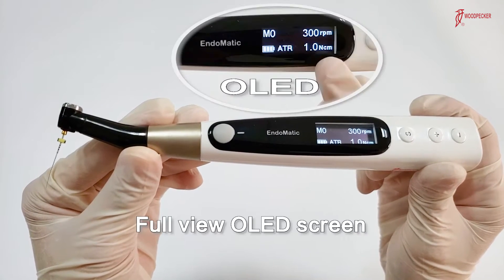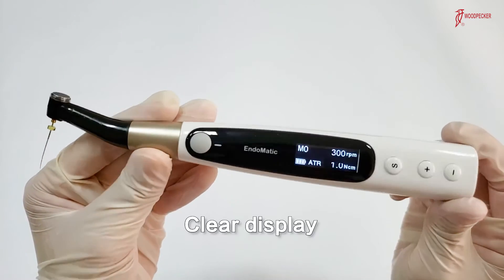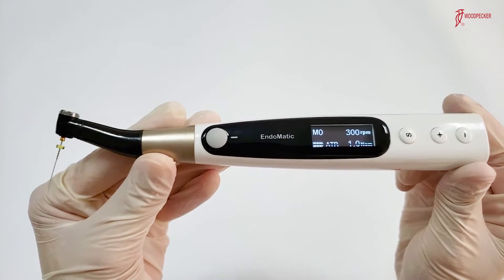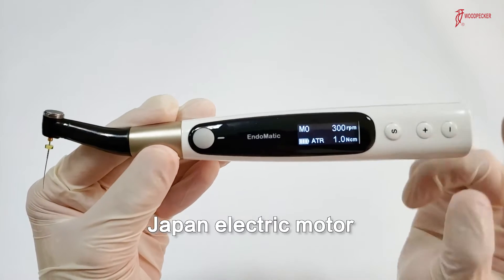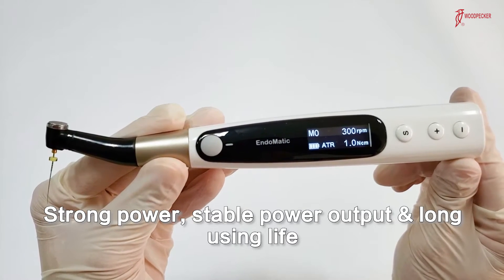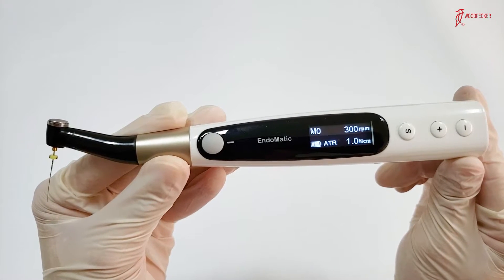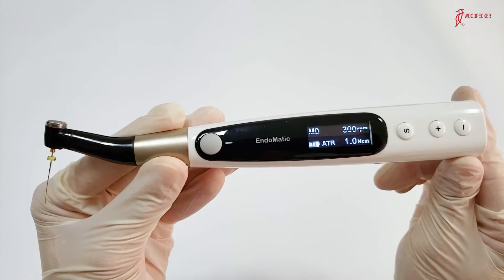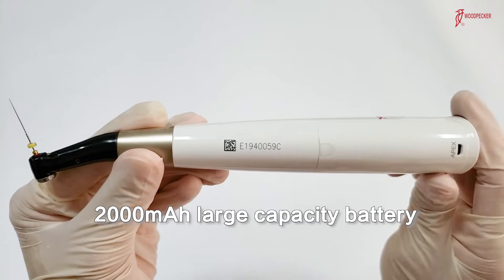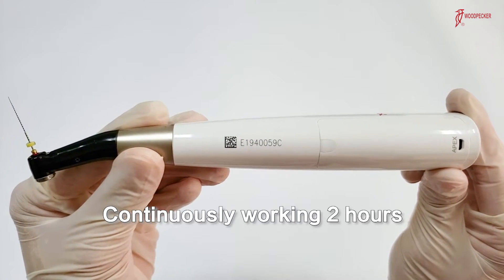EndoMatic adopts a full view OLED screen, so it's easy to see the information on the display from all angles. EndoMatic has a high-quality Japanese electric motor, ensuring strong power, stable output, and long service life. To ensure operating time, EndoMatic adopts a 2,000 mAh large-capacity battery, so it can work continuously for 2 hours.